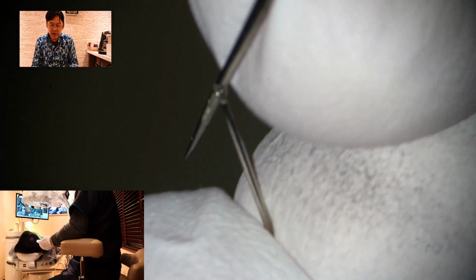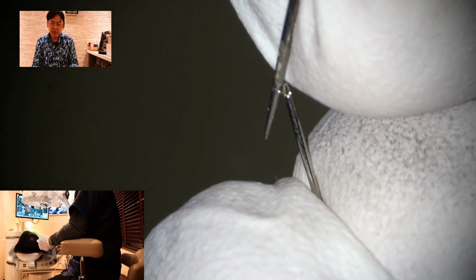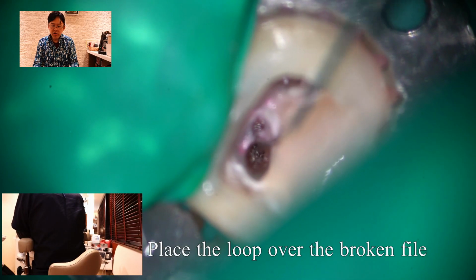So I like to use the loop to get the instrument out because the length of the broken instrument is more than 4.5 millimeters. So I'm going to place a loop over the broken instrument and tighten it around it. It slipped through.